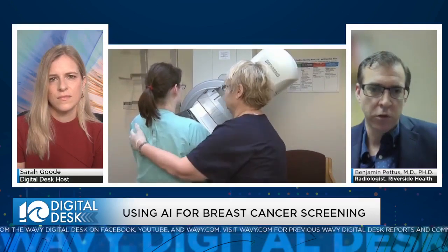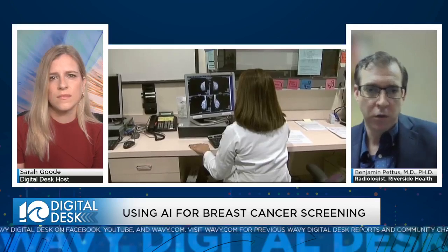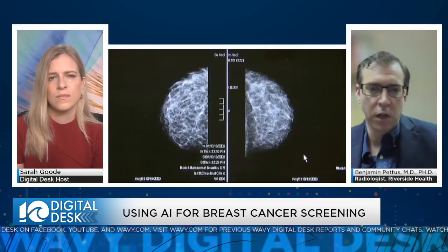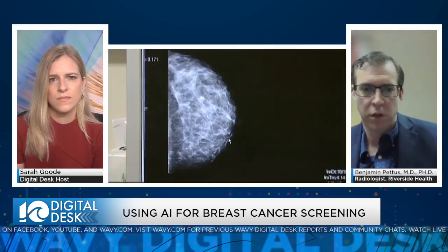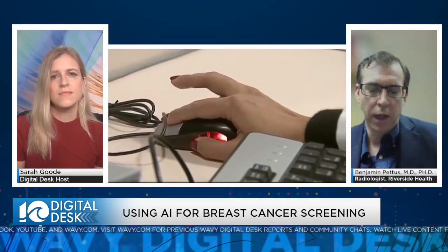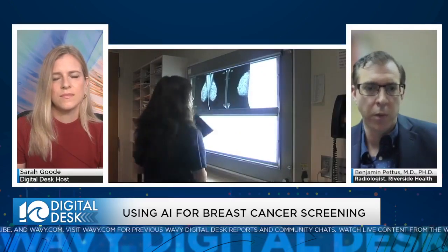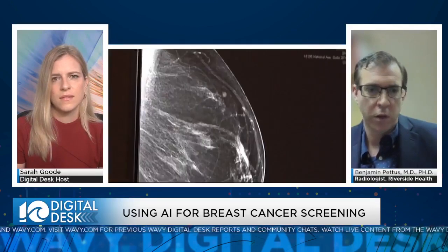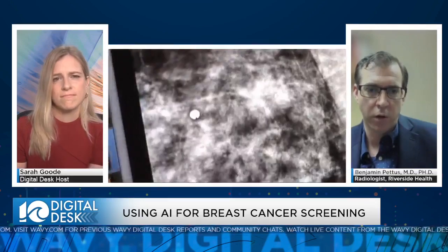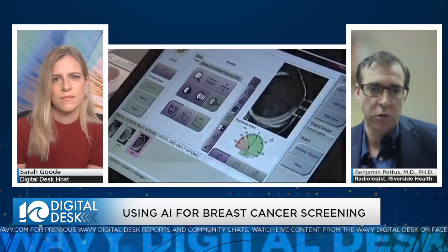I mean, there's no perfect test because everybody's body is so different. So the patterns, there's a lot of complexity there, variations in tissue density and the masses and the calcification. So anyway, there's a lot of things that make it a challenging technique. And for that reason, we've developed a lot of other tools to partner with mammography as needed. We have all those available as well, including a contrast mammogram, a breast MRI for high risk situations. We have a nuclear tracer test for sort of rare problem solving situations.